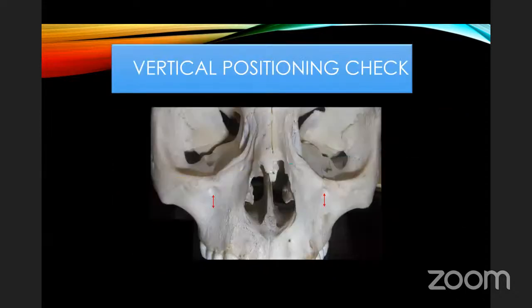For the superior-inferior position, I will place the implant at the infraorbital foramen, and when I get the implant secured on one side, I will take note of how far away I am inferior to that foramen. So when I go to the contralateral side, I can again index that to be the same distance away from the foramen.